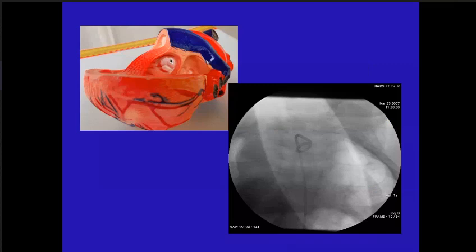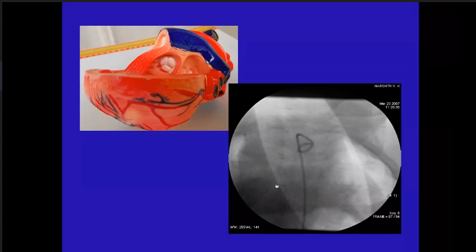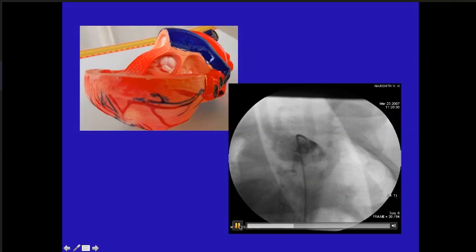Now this angio also I showed you some time back. Can you tell me what view is that? Laid back view. What is laid back view? Explain to me. AP caudal. No, this is not PA caudal. This caudal is right, PA is not correct. The ribs are all oblique, no? It's a LAO, no? The heart is a shallow LAO, okay?